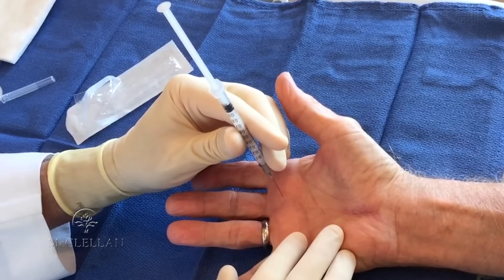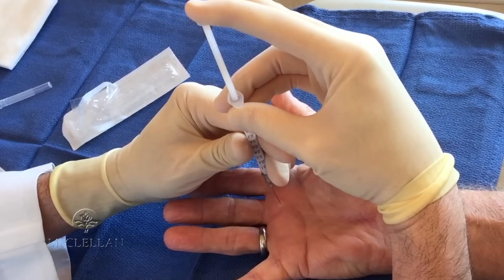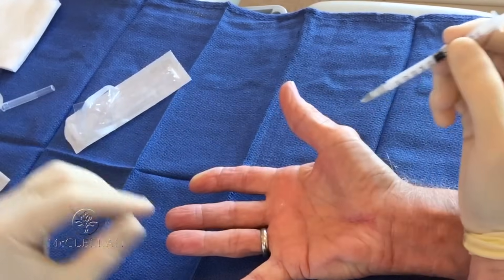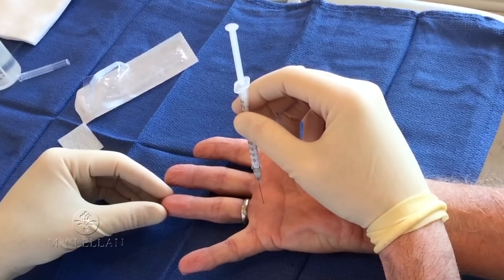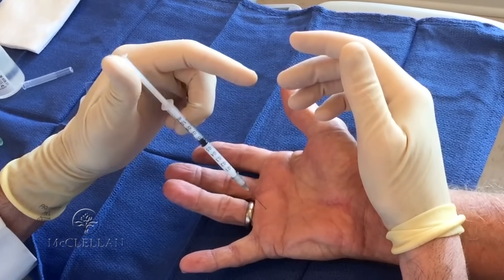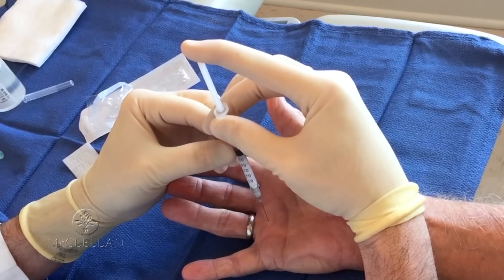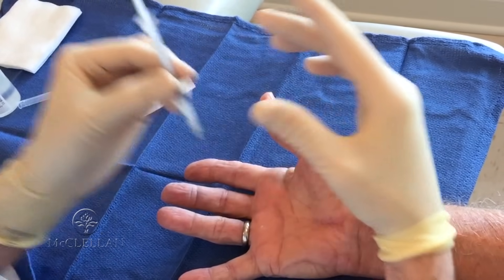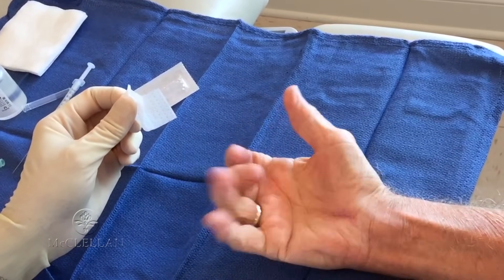Wiggle the tip of your finger a little bit — see it moving? That's too far in, so I'm going to back off of that a little bit and just really easily push it in, and it should go in nice and easy. I do about 0.4cc. Now I'm going over to this side — going in right there. Wiggle the tip of your finger. I felt resistance, I back up a little bit, and now I'm right in the sheath. Make a fist for me, extend it out, make a fist, extend it out.